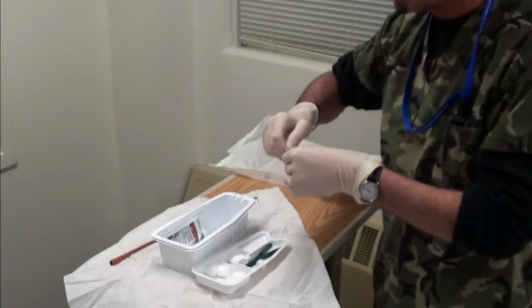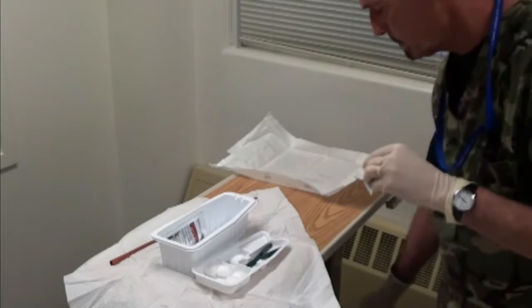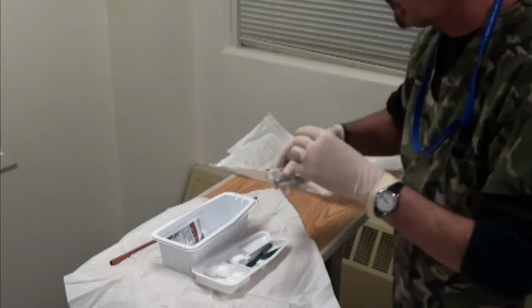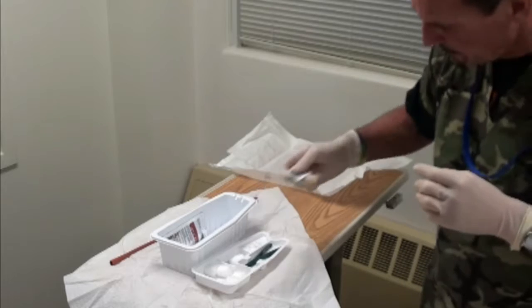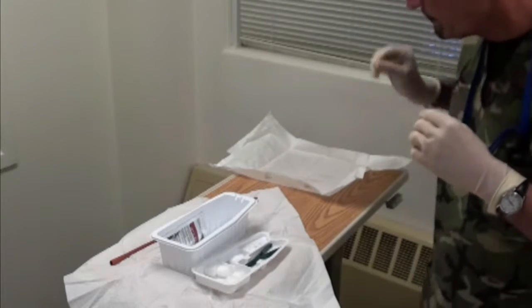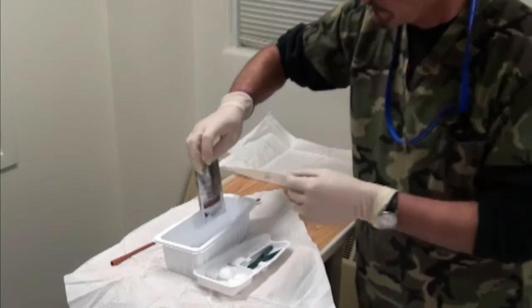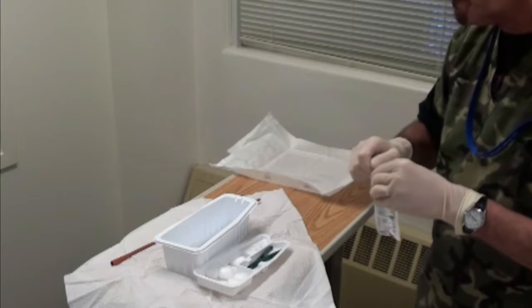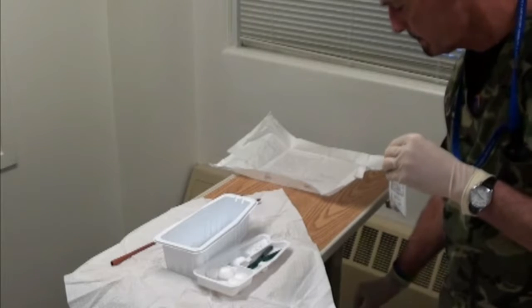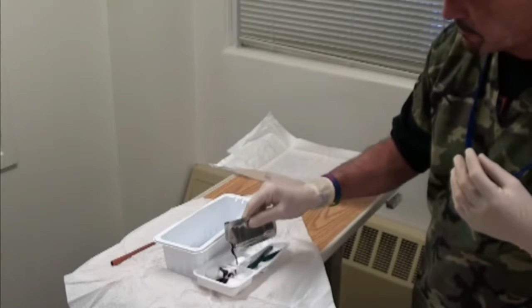I'm going to open up my lubricant and put it in the space on the tray. Open up my iodine and saturate the cotton balls with it.